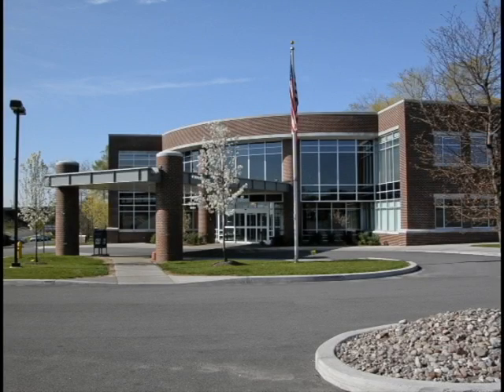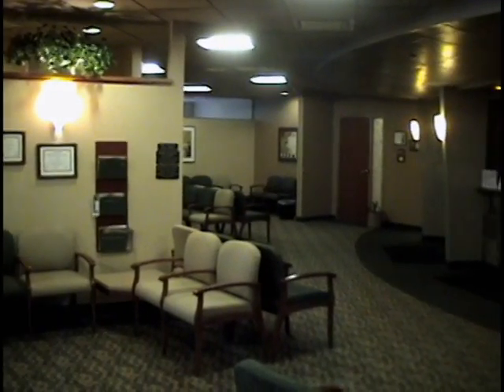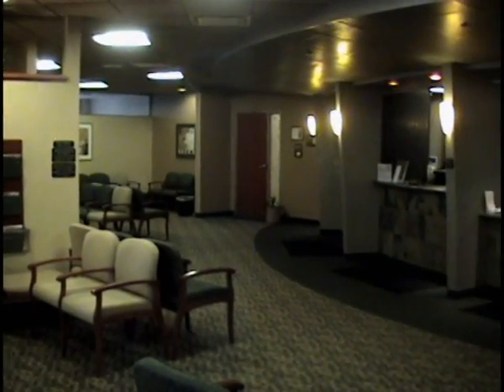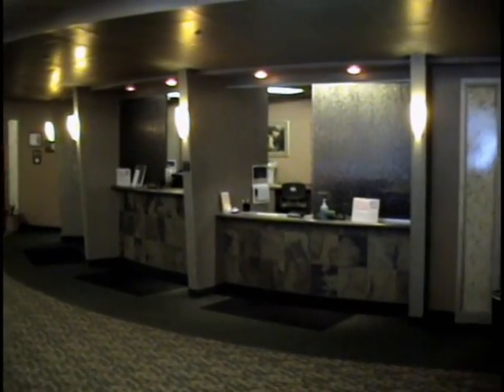Hello and welcome to UCVA. This video clip will provide you with information on a stress echocardiogram, also referred to as a stress echo.